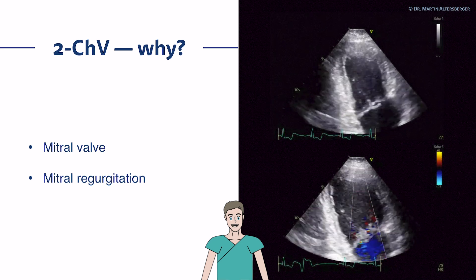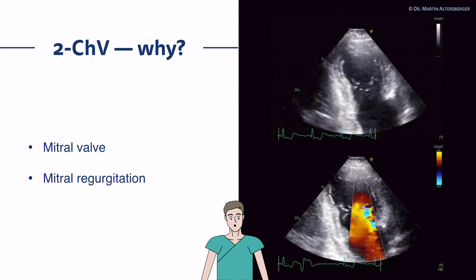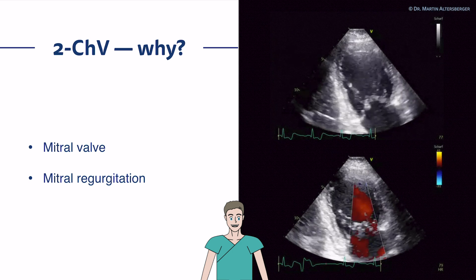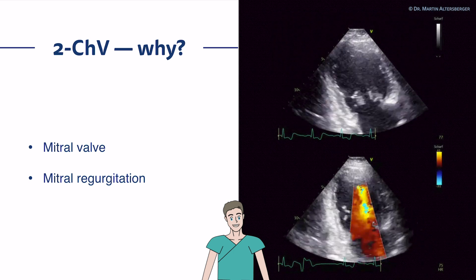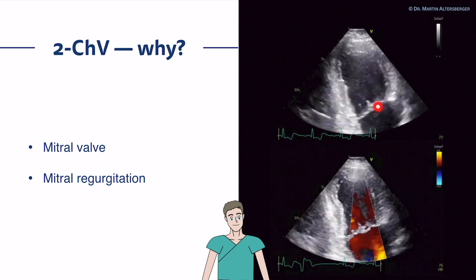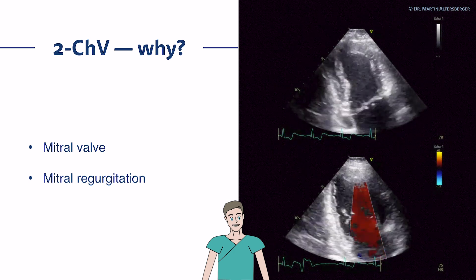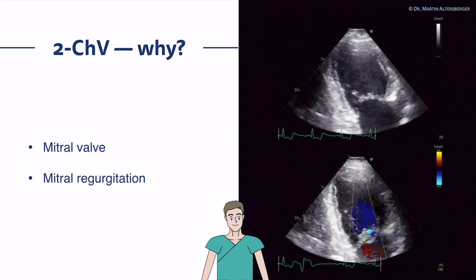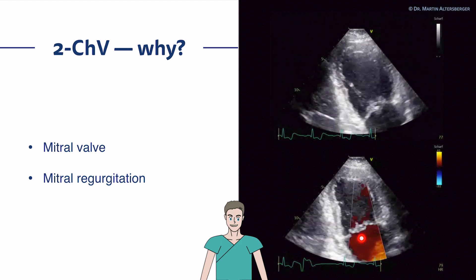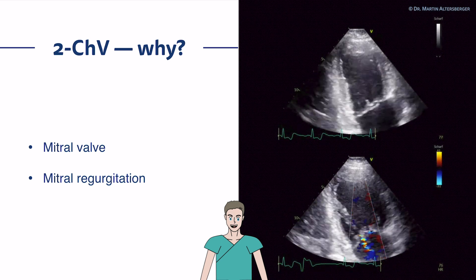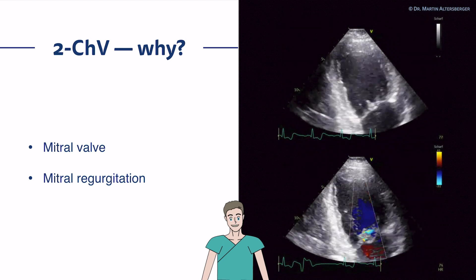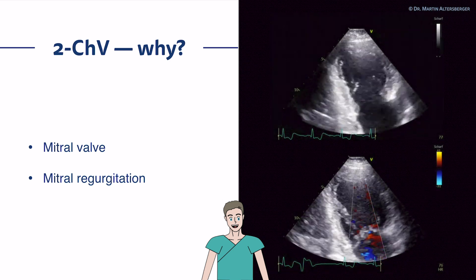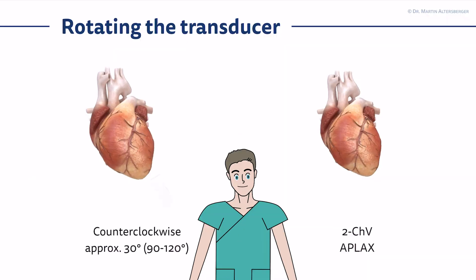Why the two-chamber view for the valve? It's about the mitral valve — mitral regurgitation, mitral stenosis. Here in this case, you see nicely a flail leaflet. Here you see it as well: the truly broad jet origin in this patient with a flail leaflet, which part of the mitral valve we will discuss shortly.